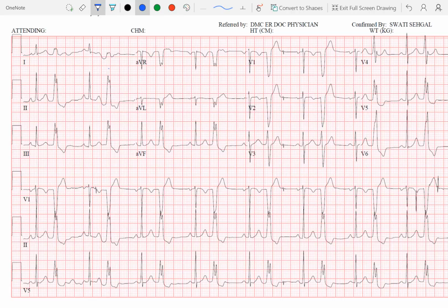Okay. You will have some sort of S wave or a Q wave in those leads that will tell you that it's not completely coming from the outflow tract. If it's coming from the outflow tract region, then there is no His-Purkinje conduction system that can cause that morphology of a QRS there. Okay. So that by default proves that this is an outflow tract PVC. Mm-hmm. So there are other clues too that you can look at.